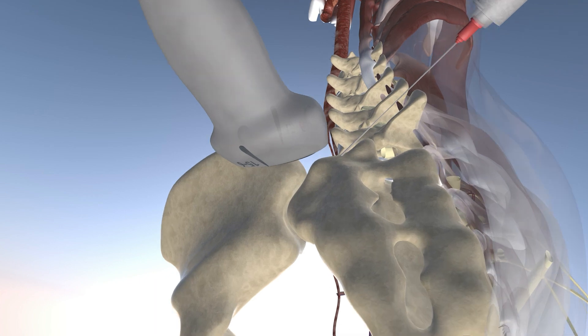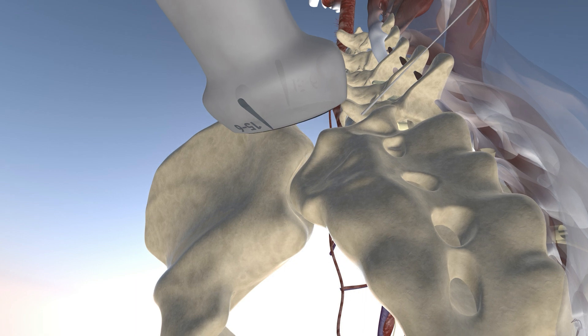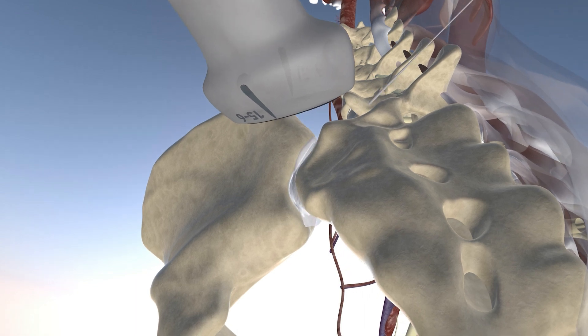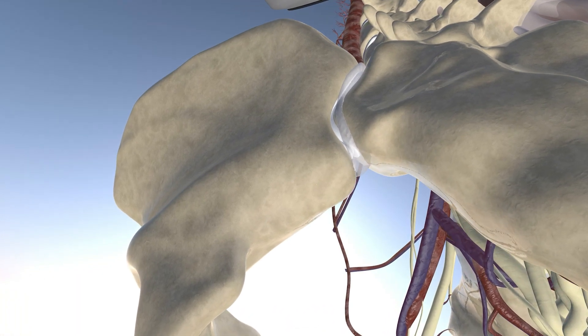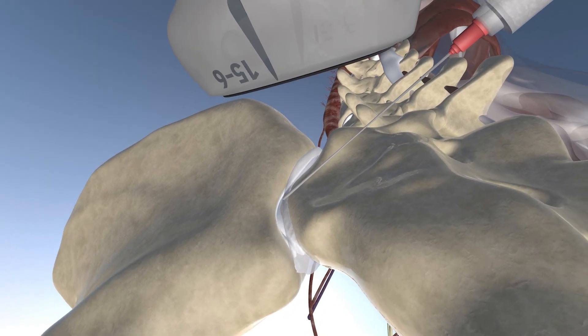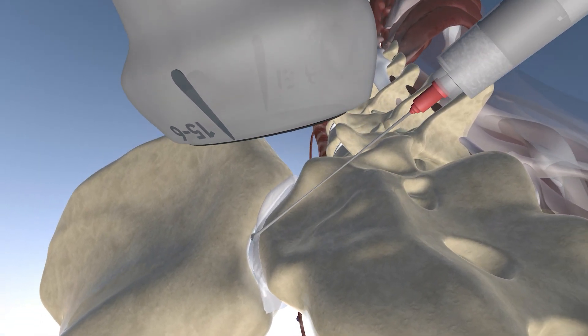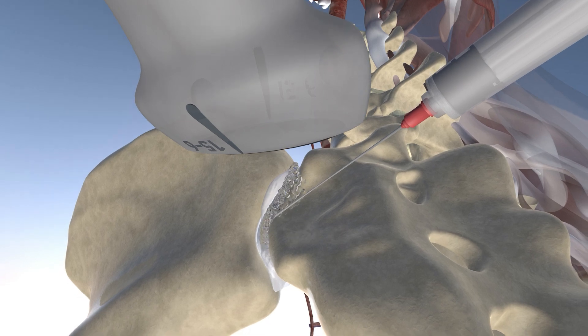Here we are showing the orientation of the probe and the needle during this procedure, where the probe is in an axial oblique plane. This is an in-plane approach going from medial to lateral, essentially going into the sacroiliac joint. This entry point is lateral to the posterior sacral foramina. Here you can see the injectate going into and around the sacroiliac joint.